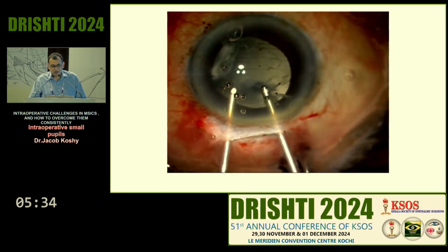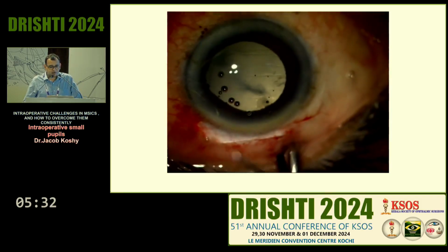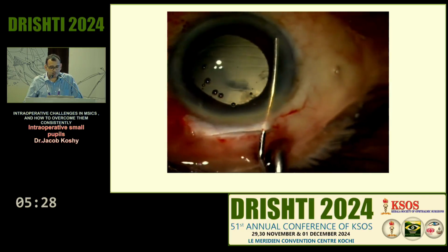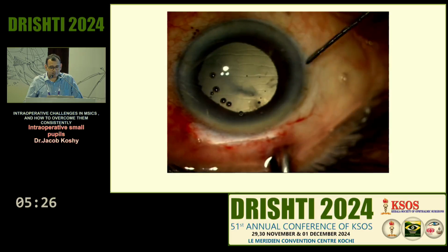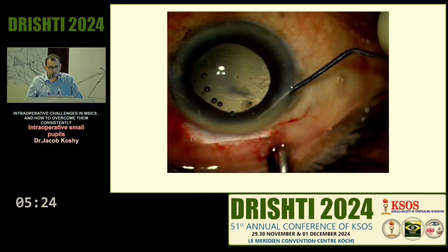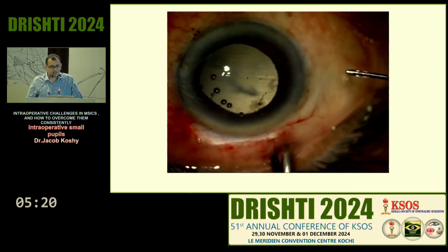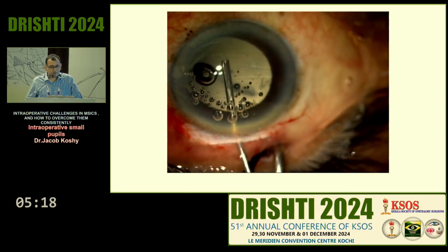Sometimes this triamcinolone might go a little back, and on retro it will look a little white, and you might start wondering, oh, have I caused a detachment or anything, but generally they are okay. Remember to keep sweeping on top, and you can see a little bit of vitreous tag there, things like that, so that you know what to remove.